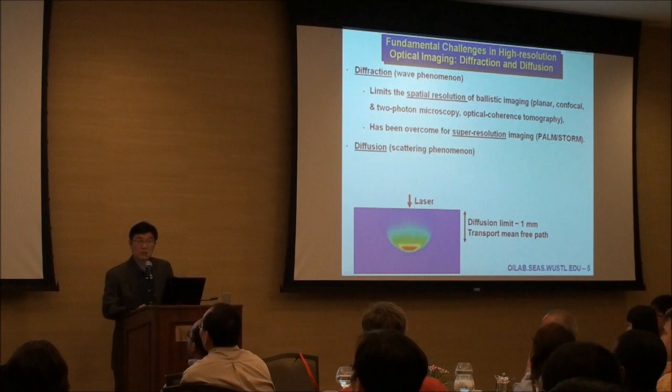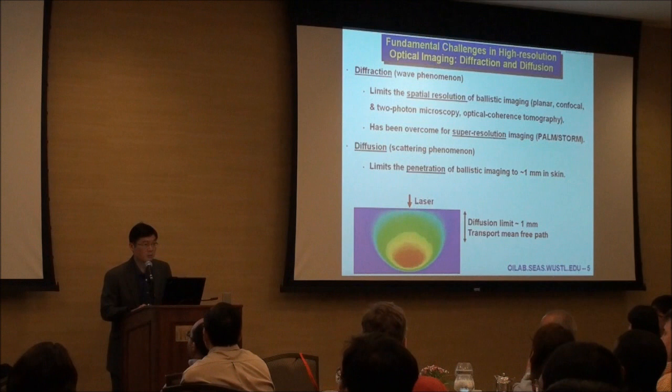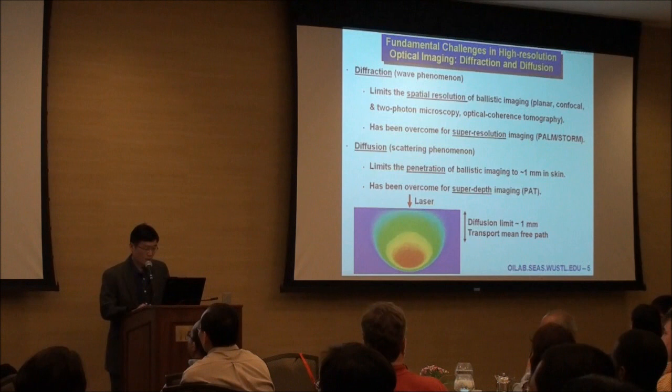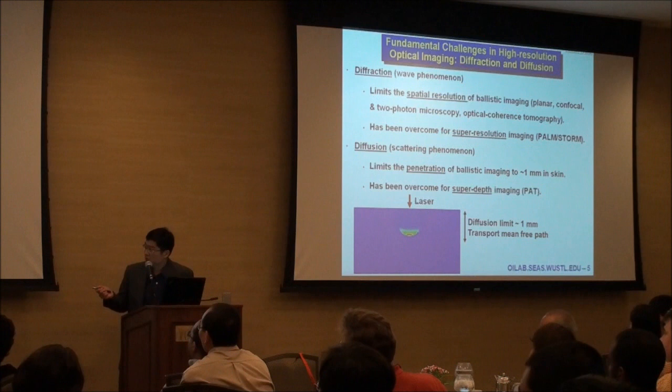Diffusion is a scattering phenomenon. It limits the penetration of all ballistic imaging modalities to about a millimeter in the skin. So we want to use photoacoustic tomography to overcome this limit, to provide you what's called super-depth imaging. And the movie here shows you how quickly photon propagation transitions from the early ballistic regime into the later diffusive regime.